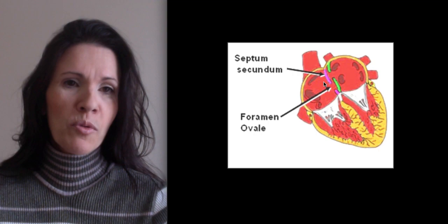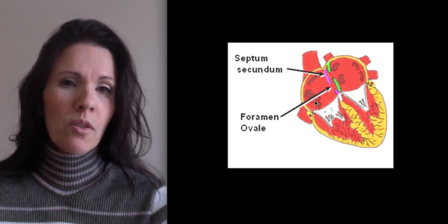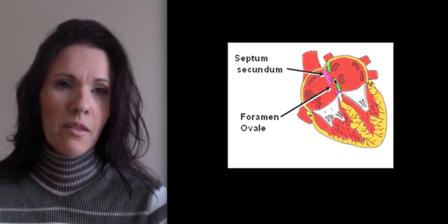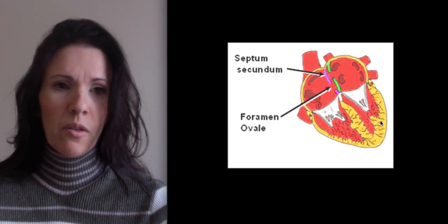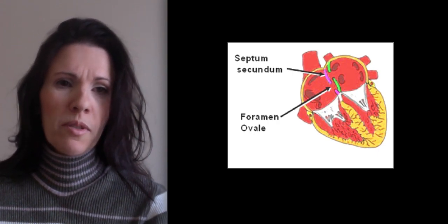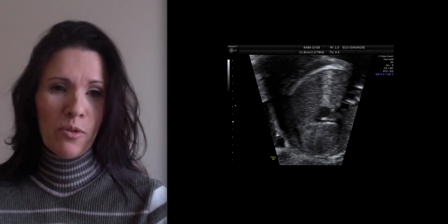this is septum secundum, this is the flap of foramen ovale, and this is the primum part of the interatrial septum. This is in green, the septum primum. If you want to understand the embryology, you can follow some videos and even books. And this is the normal coronary sinus.